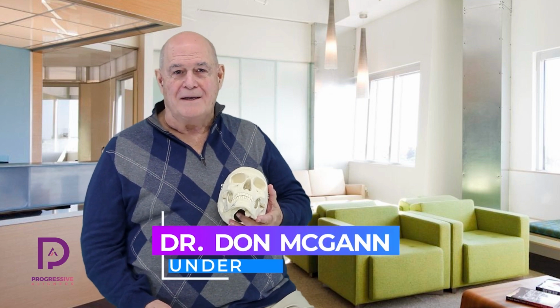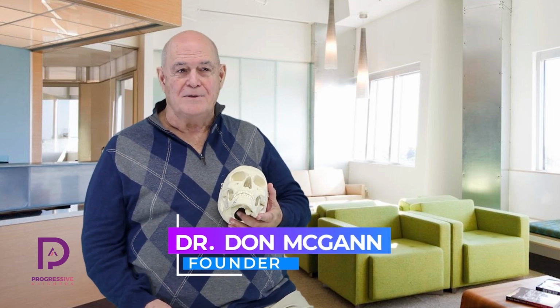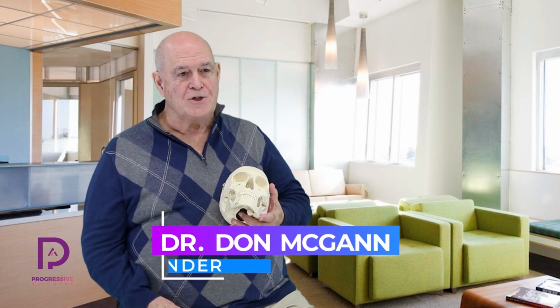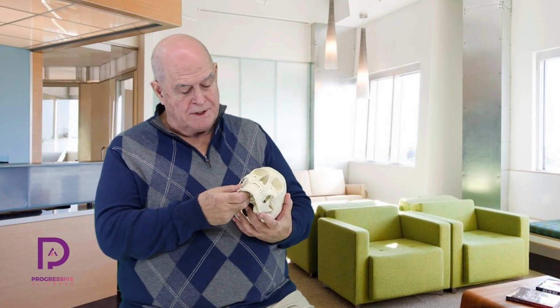Hello, I'm Don McGann, and I'd like to talk to you right now about a functional shift of the jaw to one side or the other. And I have a skull here to try to illustrate this. And right now it's in a class 1 position, right and left.